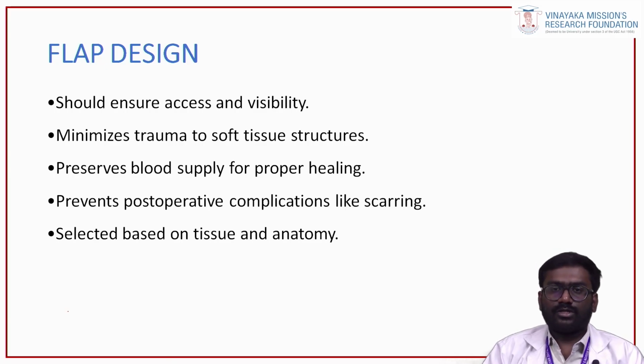The first and foremost thing is you should have adequate access and visibility. We cannot work in a tunnel. We have to have a clear picture, a clear area of infection, a clear demarcation between healthy and infected tissue, and we should have adequate access to approach and treat that area. So you should have adequate access, illumination and visibility.